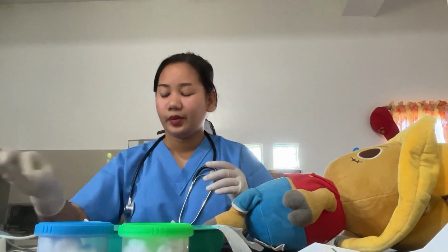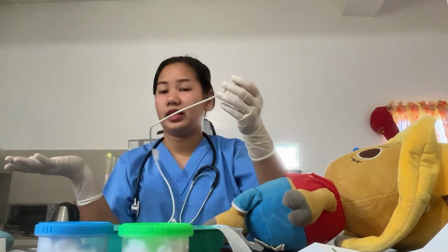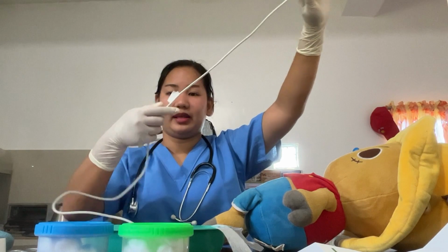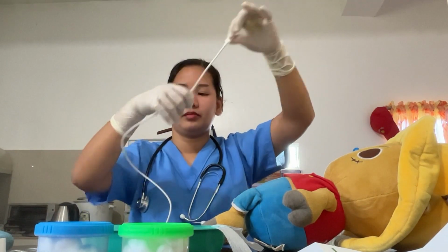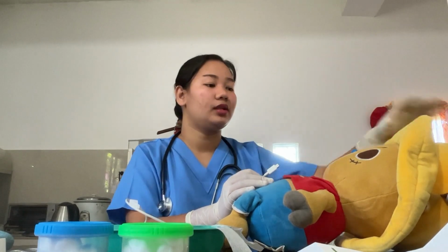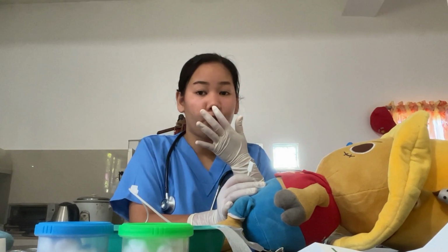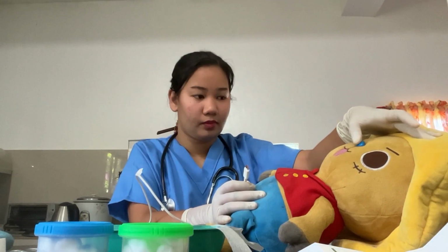And after that, you're going to lubricate this tube. So let's assume that we already lubricated this. Okay, now for the insertion, I will ask the patient to flex her head. Please flex your head. And then I will tilt her nose upward.